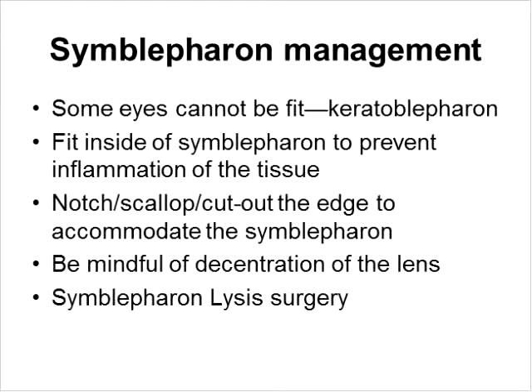And if you don't notch it out enough, the symblepharon could actually still push the lens and decenter it to the opposite side and cause impingement on the other side. And then lastly, an extreme management is to recommend symblepharon lysis surgery with mitomycin C. Symblepharon treatment is challenging because they do tend to recur.